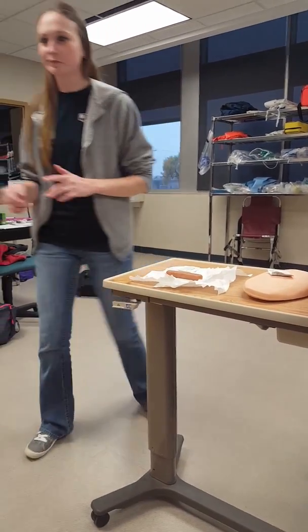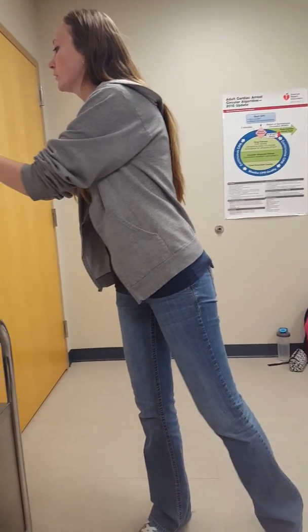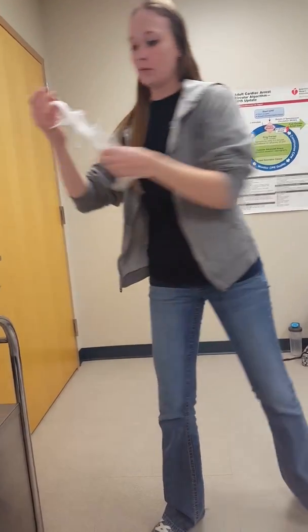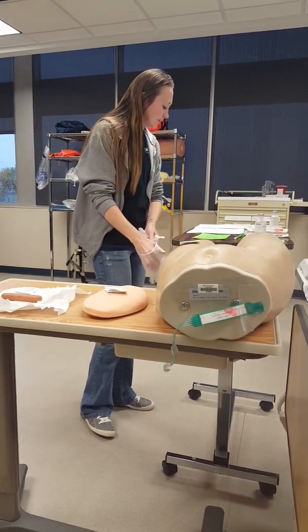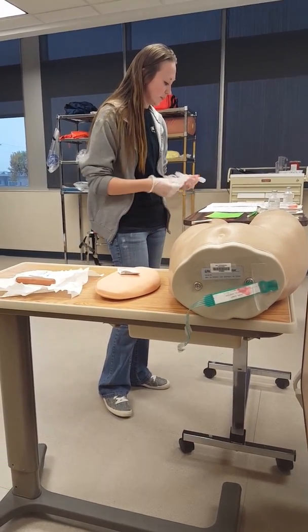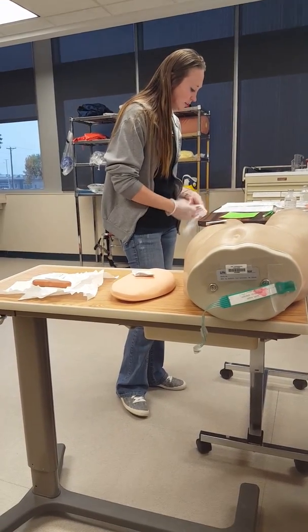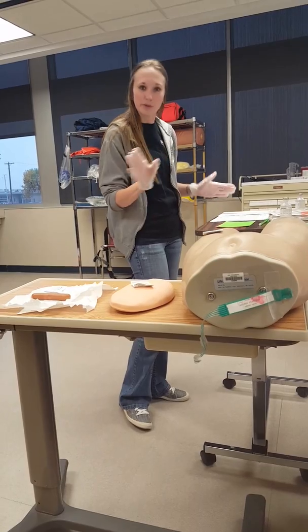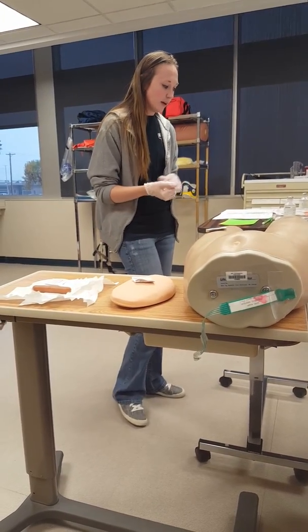How are you today? Good. I'm going to be doing some injections today for you. Is that okay? Yeah. Can you give me your name and date of birth? Tiana Kelly, 3/16/97. And do you have any allergies? Sulfa. Okay, and I'm checking that on your doctor's orders here, and your name is this person I'm supposed to be doing it on. Okay, and I'm going to be using gloves for this.